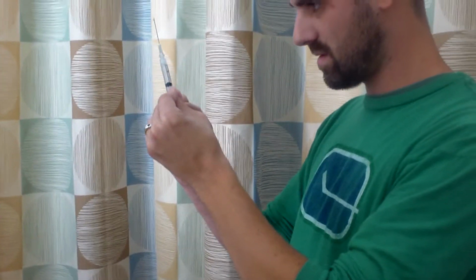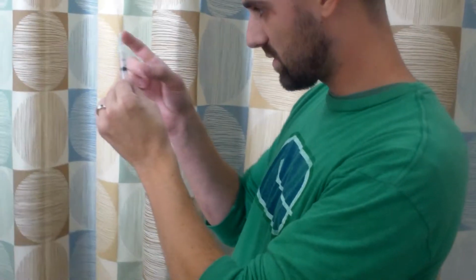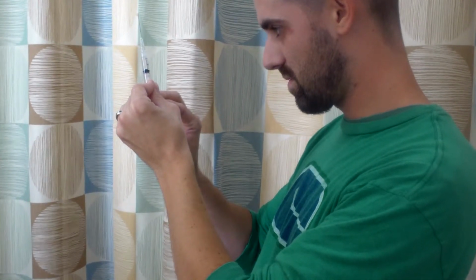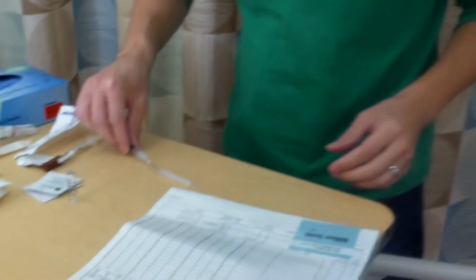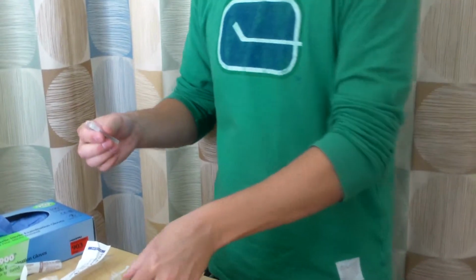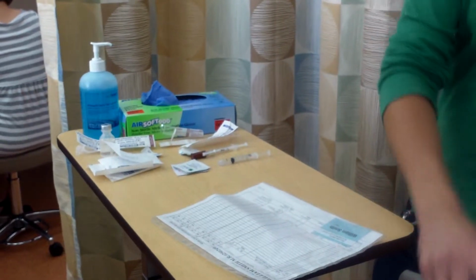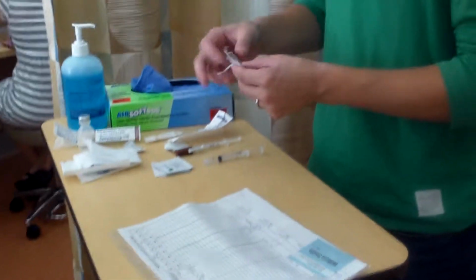So then, there you go. Just push that up, make sure there's no air bubbles out, and the appropriate medication. There we go. So I have that. I need to take my filter needle off. So I'm going to scoop that up, cap that. I'm going to remove this and put this along with the rest of my ampule in the sharps container. So that goes in the sharps in my med cart. I'm going to save this, however, for later, but that goes into the sharps.